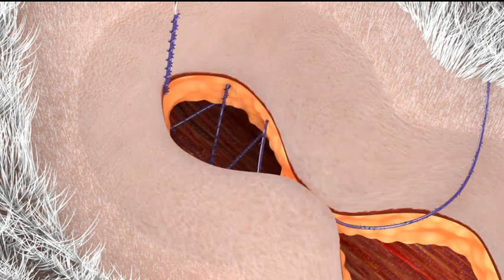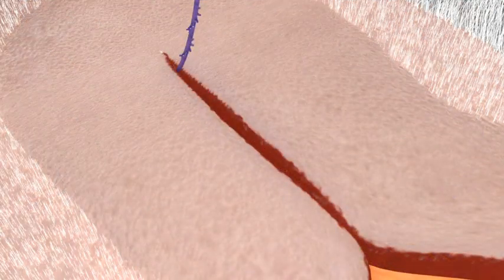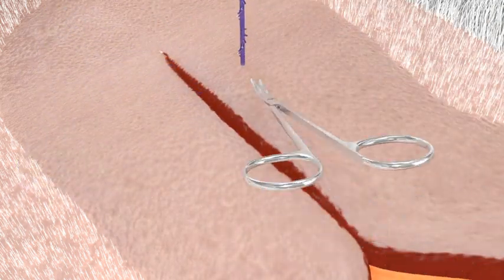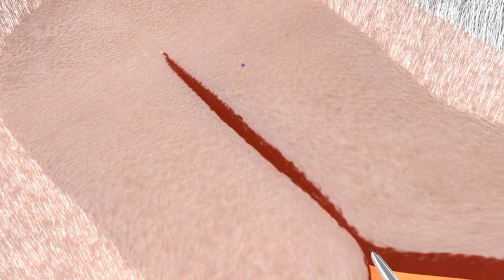Once the apex of the wound is reached, make the appropriate backstitch with the first arm by exiting lateral to the incision and cutting the remaining Quill device flush with the skin.